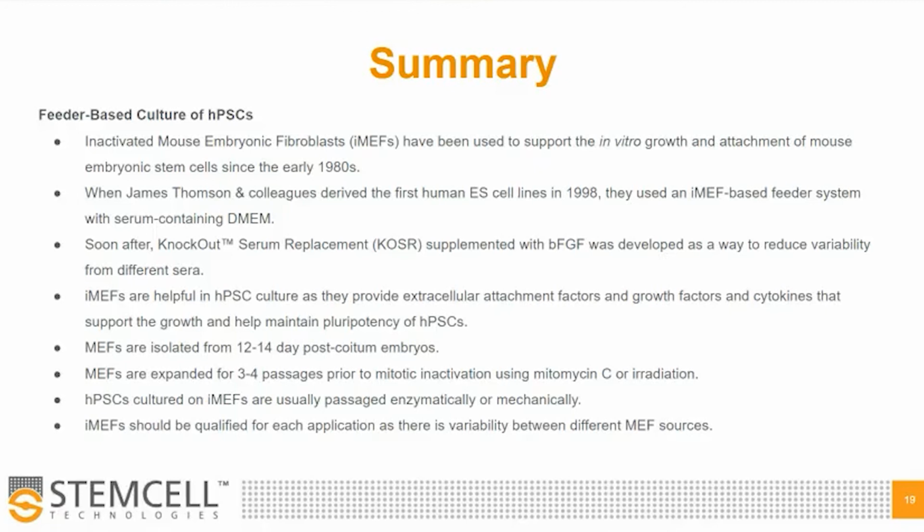MEFs are isolated from 12 to 14-day post-coitum embryos. MEFs are expanded for 3 to 4 passages prior to mitotic inactivation using mitomycin C or irradiation. HPSCs cultured on IMEFs are usually passaged enzymatically or mechanically. And finally, IMEFs should be qualified for each application as there is variability between different MEF sources.